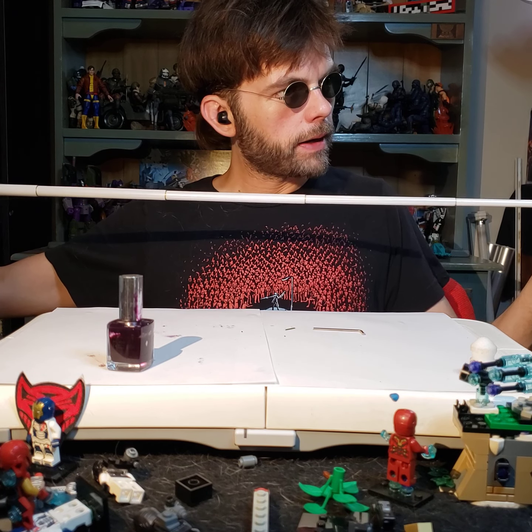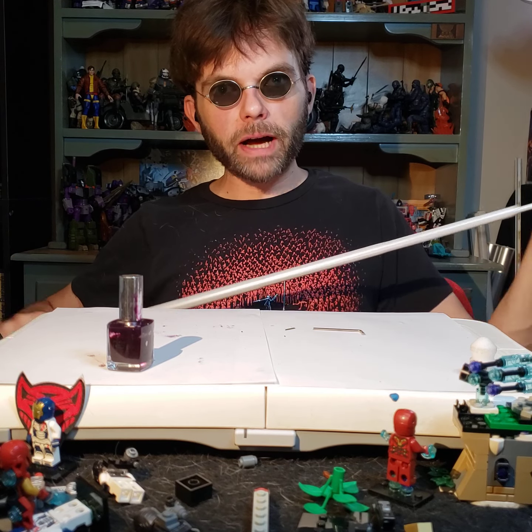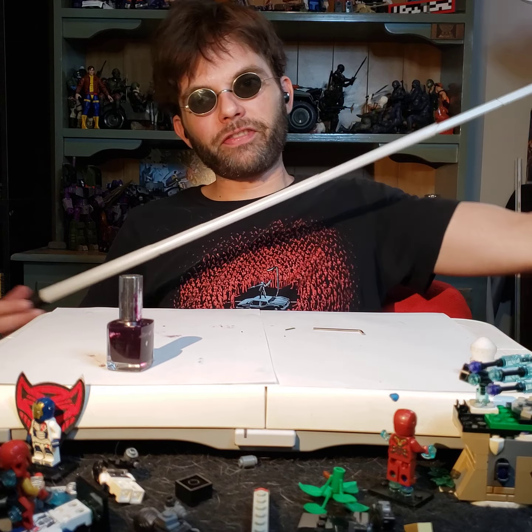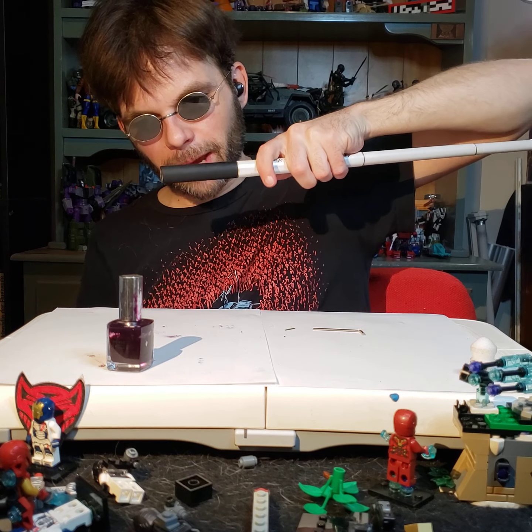Oh, look at that. It doesn't pop out. That's exactly what we wanted. You saw how easy it was for me to pop this thing out before? Oh, I forgot to put the cap on before collapsing it. Remember, put the cap on your cane before you collapse it back down.